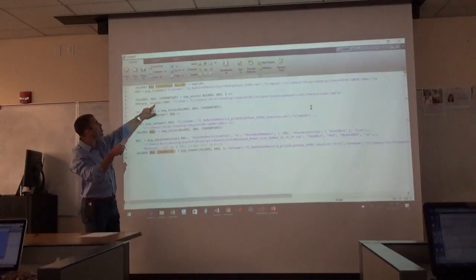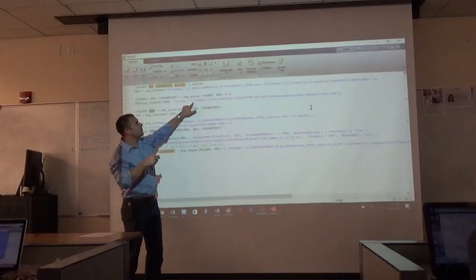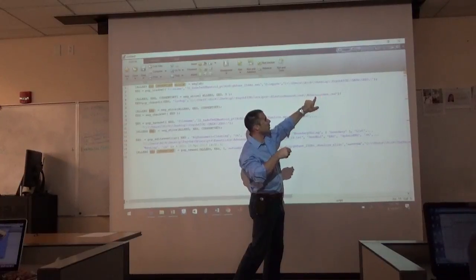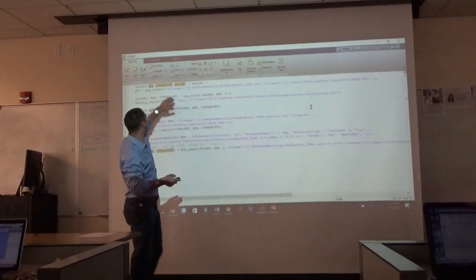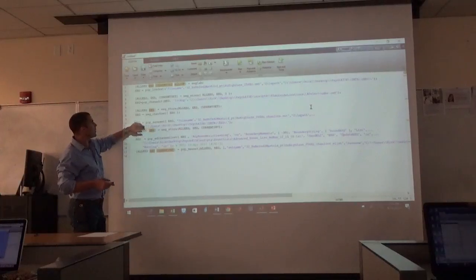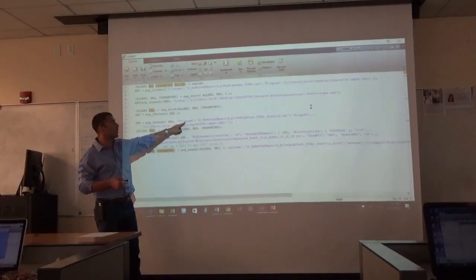Well, we edited the channels. So channel, edit, and we looked up this directory of electrode locations with this 40 electrodes file. Pretty easy, right? Okay, so we loaded the data set, then we edited the channels. Then we basically saved it.